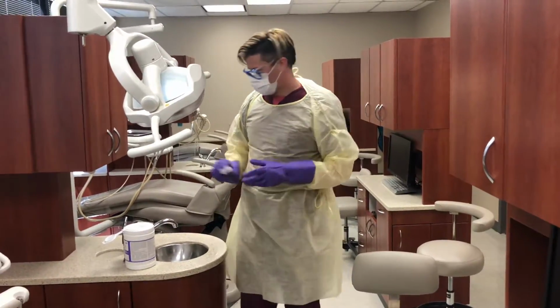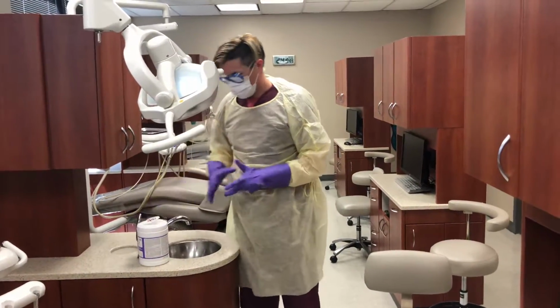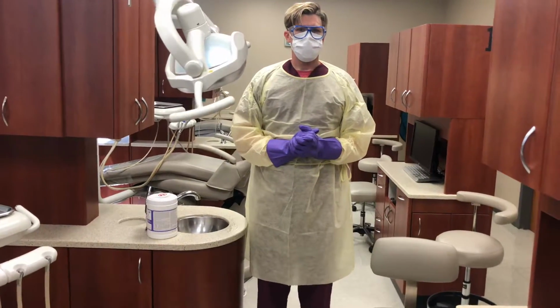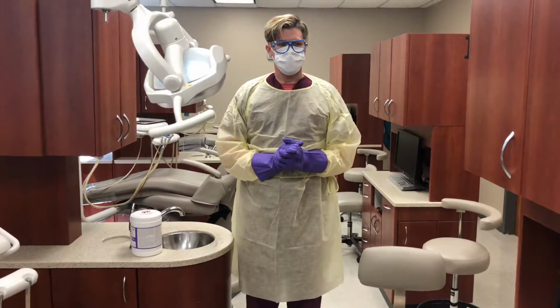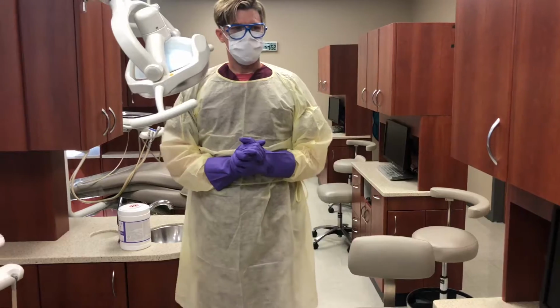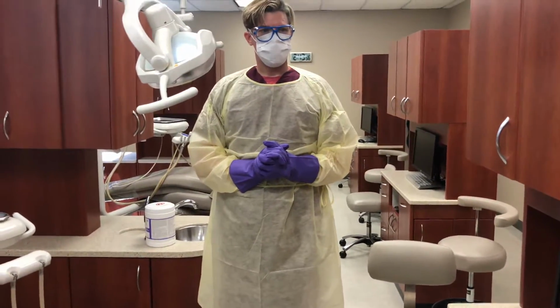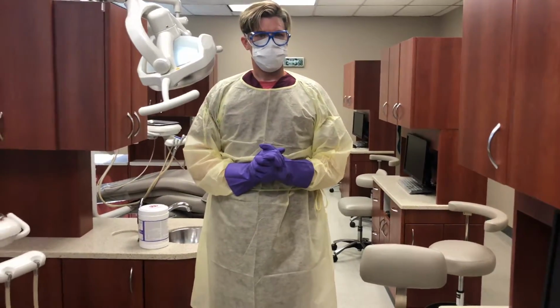Repeat the above Virex cleaning step to disinfect all surfaces listed above. Allow the surfaces to soak for 2 minutes. Time is per manufacturer's directions to achieve disinfection before placing supplies for unit setup. For this purpose, we are not going to be repeating this Virex step.